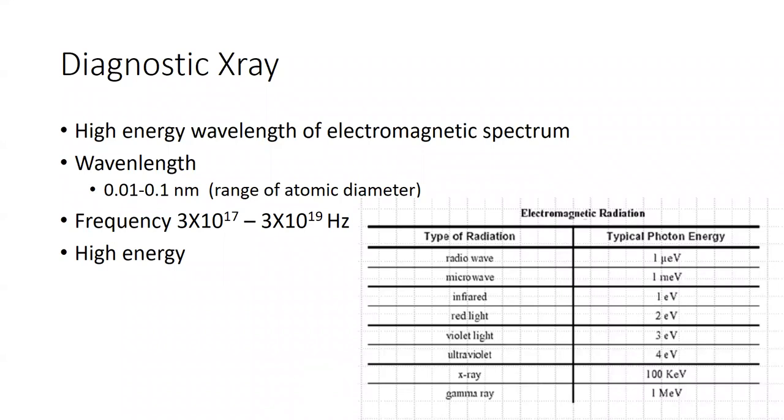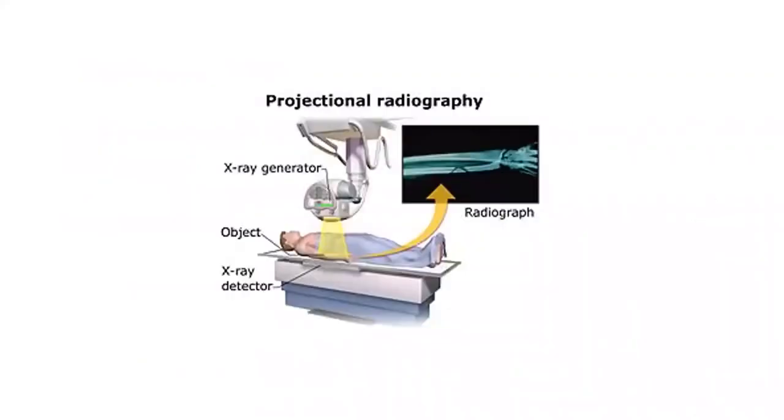Radio waves are actually very safe. They're around us all the time. Okay. And hopefully all the Bluetooth and Wi-Fi stuff that we're using in radio waves is not going to lead to damage later on, but the data is pretty strong that radio waves are pretty safe. Okay. In fact, they are absolutely necessary to generate what you call an MRI image. But X-rays are high energy. Okay. So we have to practice safety when we're around them.